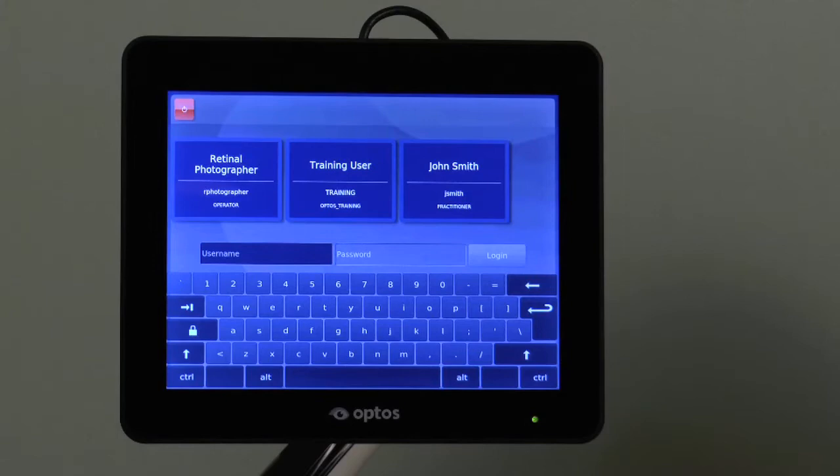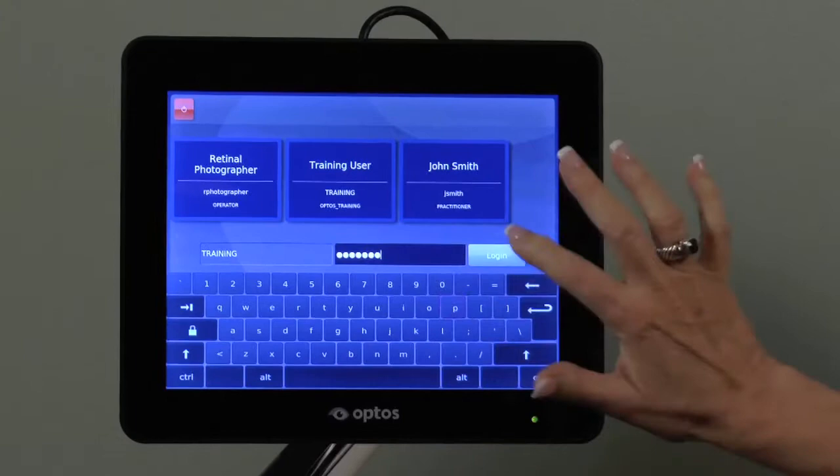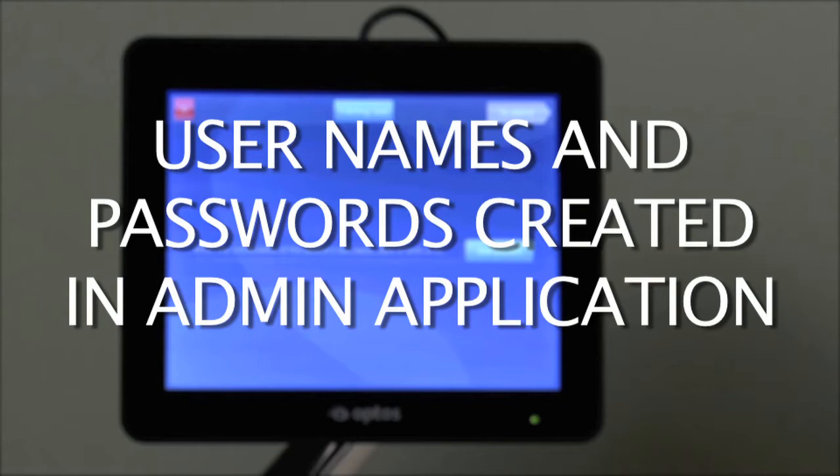To log in, enter the username in the corresponding field or choose from the cards at the top, then enter the password and tap Login. Please note that usernames and passwords are created in the Optos Vantage Pro Admin application on the server.